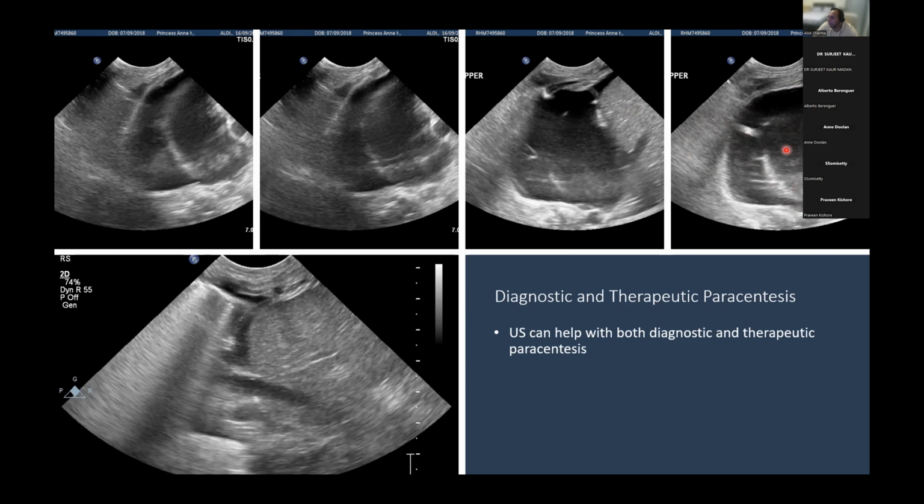And really what I'm doing at this particular point is monitoring that ultrasound, not by an extended convex scan that's longitudinal. I'm doing a transverse scan in the area where the pocket is maximum. And the benefit of being able to do that is, as I aspirate, I can see the volume of fluid coming down.